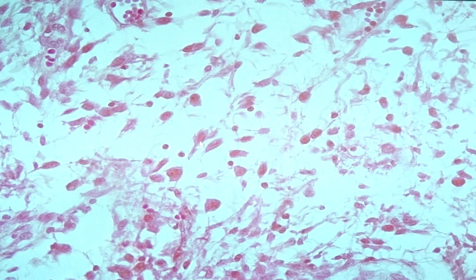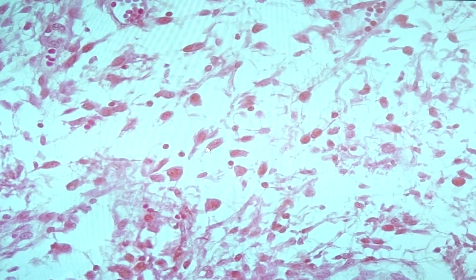If you compare this with other soft tissue tumors, the nucleus of this particular tumor would be small in comparison, but you have to compare it with the normal adipocytes. So these are immature lipoblasts with larger nuclei than the usual adipocytes, with abundant cytoplasm still. This would be positive for S100.